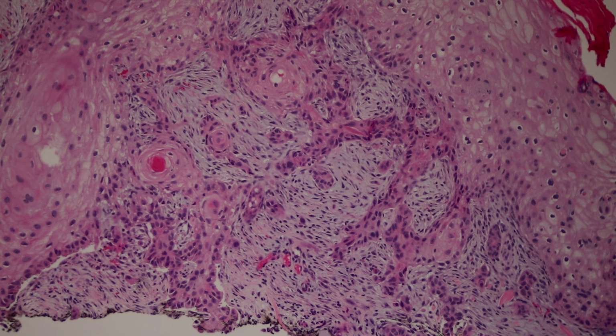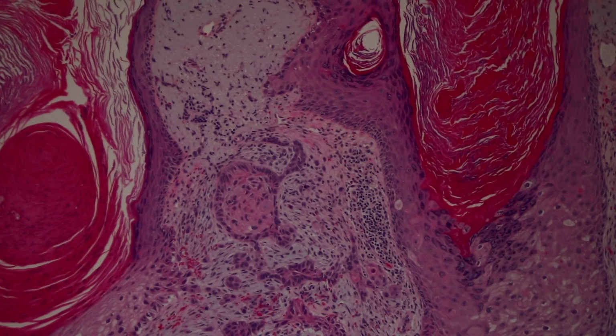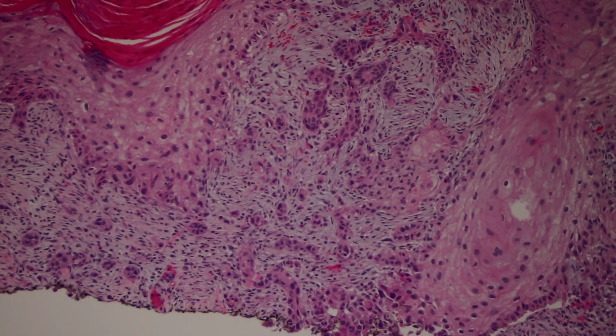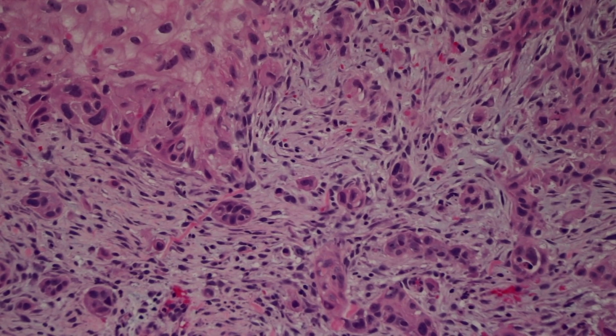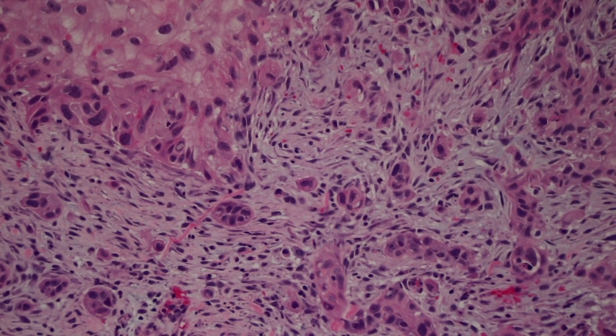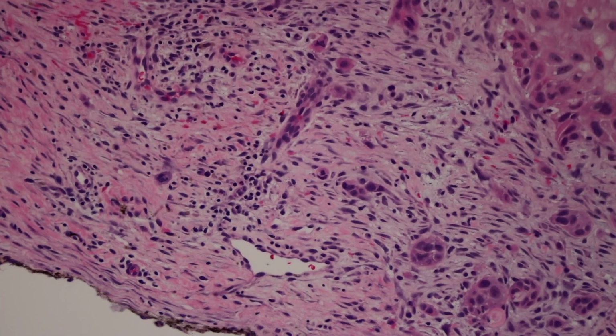I like to mention that I suspect these are more likely to be locally aggressive. I don't necessarily know if that's always true, but I worry that they might be. I also worry that my colleagues in Mohs surgery, if they have to see these, would find it easy to miss little tiny single cells of invasion or little strands of invasion. Now the stroma on the Mohs section can help, but look at how easy it'd be.